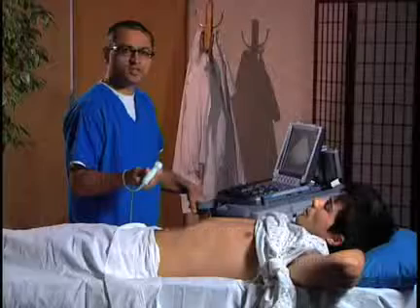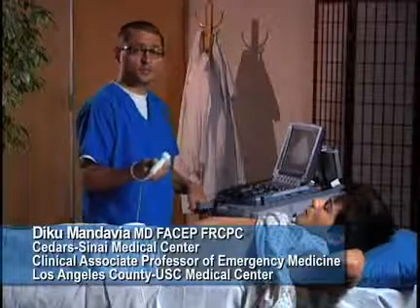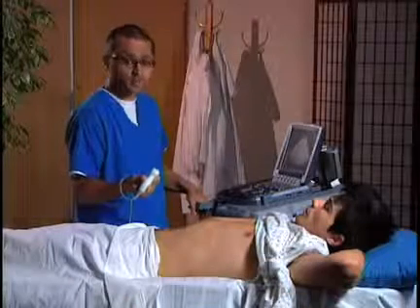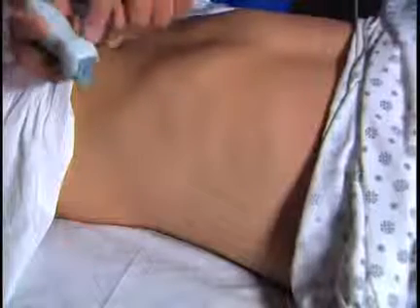The next view I'm going to take you through is the perisplenic or left upper quadrant view. This view tends to be a little bit more difficult because the spleen is smaller and doesn't provide as large an acoustic window. We're going to start again, the patient's going to be supine. This is the probe marker right here.